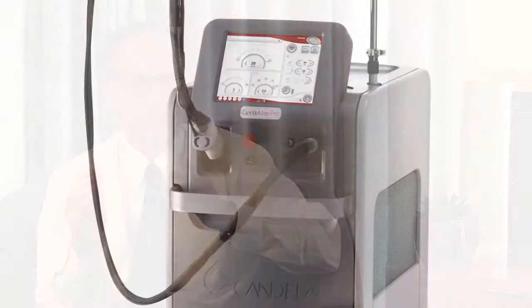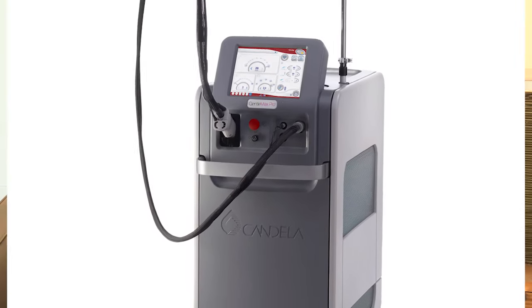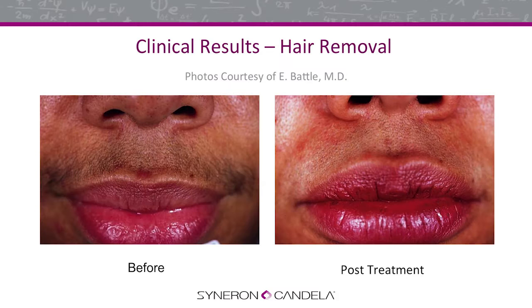The other type of system that one could consider is something called the diode. So with the diode, in order for you to be treating the darker skin types, you have to use a longer pulse duration, but then you're going to give up on the efficacy. And also, when treating the lighter skin types, the diode will not be appropriate for the thinner hairs, because you cannot get that fluence with the pulse duration, because a diode simply cannot produce a very short pulse duration. The diode cannot deliver peak energy, allowing for high fluence at a short pulse duration, and therefore you're not going to be able to treat the thinner facial hairs as you will with an alexandrite.